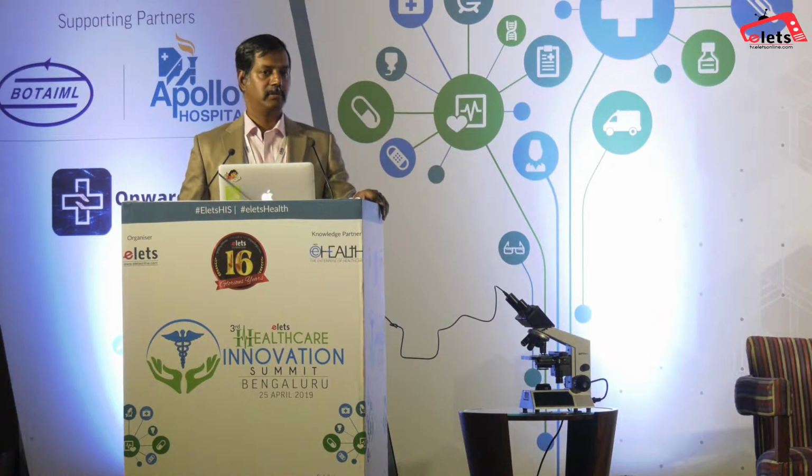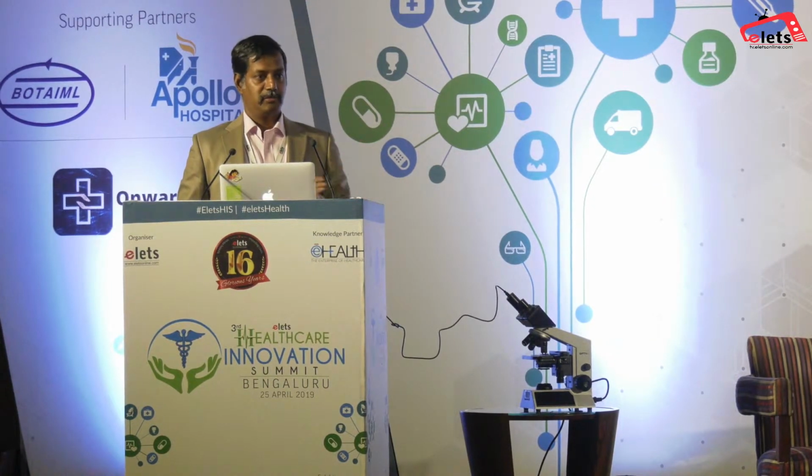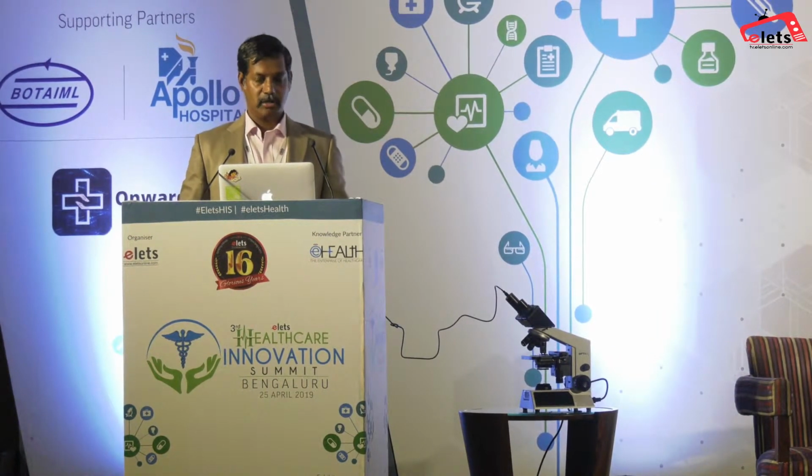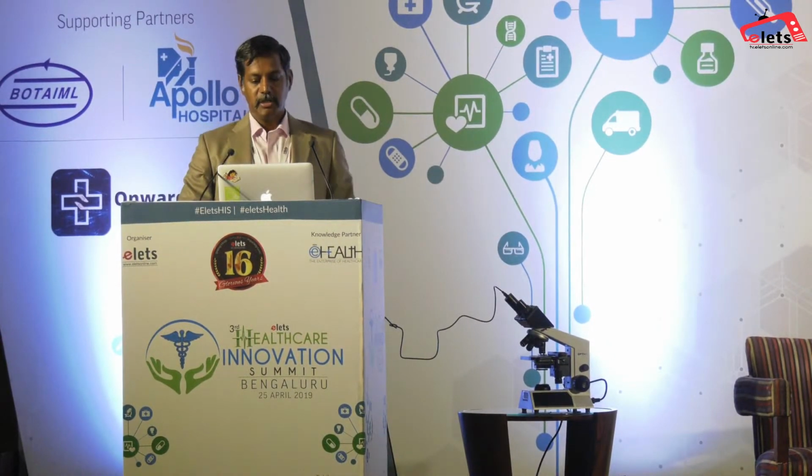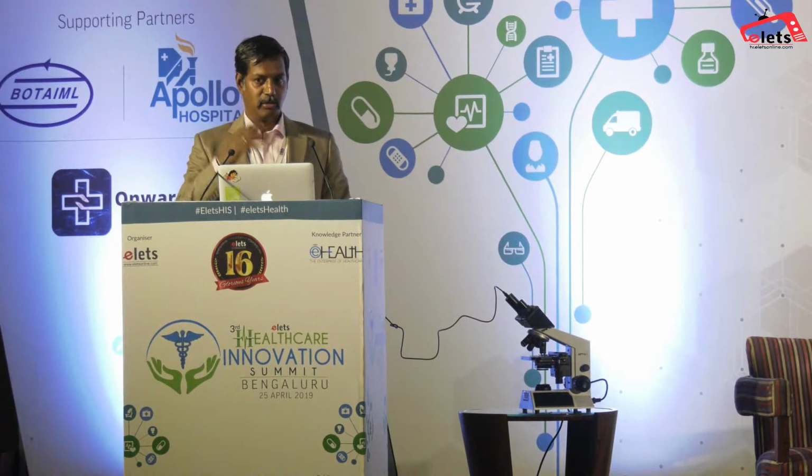We also give some training to the technician for them to identify the hotspots, because here you don't have a WSI where you're scanning the entire slide image. Here they're primarily trained to take about 20-30 images.